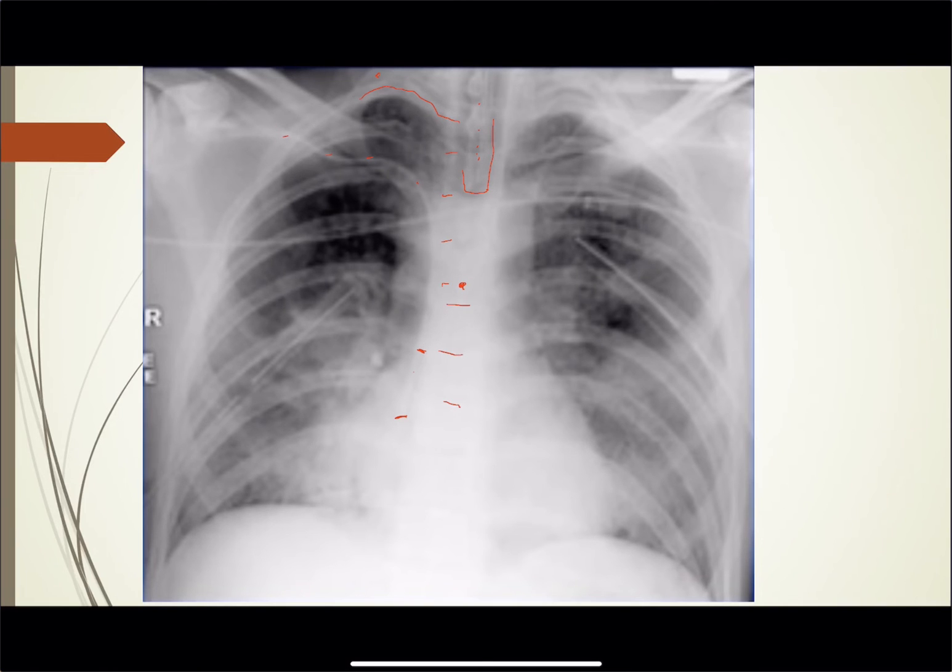I would pull it back right about here, which should be about the SVC junction — the cavo-atrial junction is probably about right there, so either of those two places are fine. You can see a couple of tubes here: that's a chest tube, and over here you can see another chest tube. Those chest tubes are in pretty good position. Just make sure there are no holes out — all the eyelets have to be inside the chest.